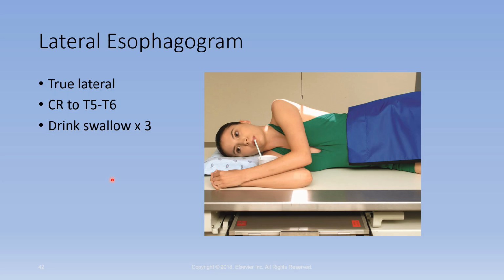You're still at a 40-inch SID, still a 14 by 17 portrait. You're still going to be centered to T5, T6. And the patient is going to have to drink, swallow, drink, swallow, drink, swallow.